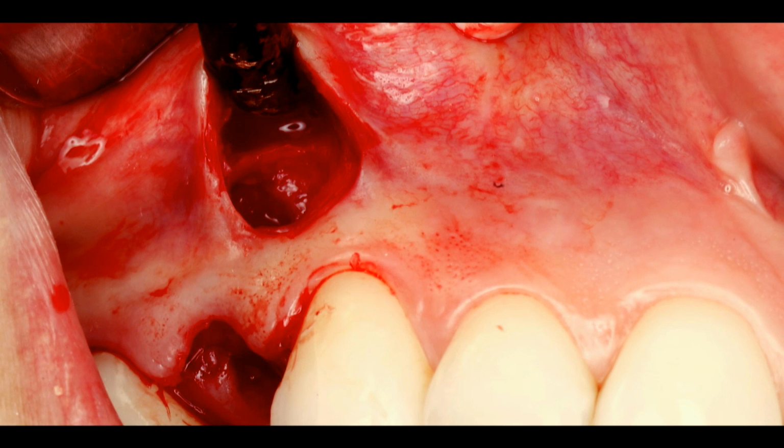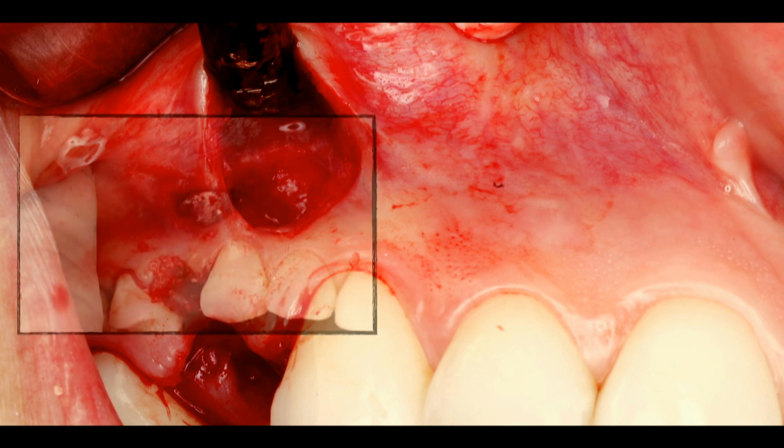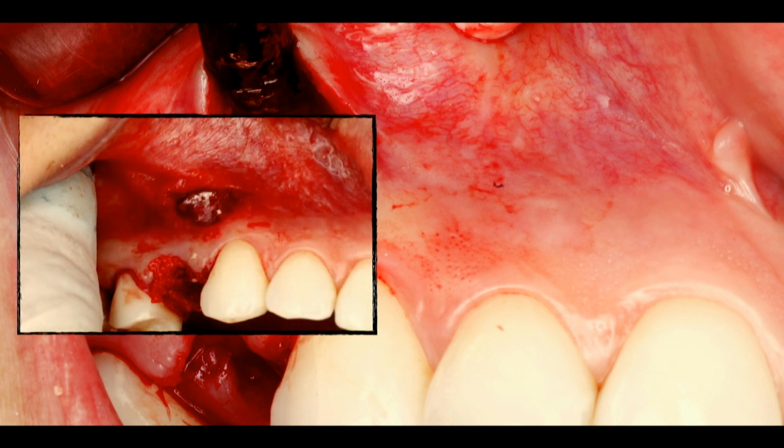I did have the marginal bone intact, but I had that defect apically. So we're going to clean that out through a semi-lunar incision. This is going to scar up here, right? But at least it's out of the smile line. And you can see that I was able to actually tuck that BioXclude membrane in. This type of defect, if we get it cleaned out, is going to heal very well. The defect's within the housing of the bone.